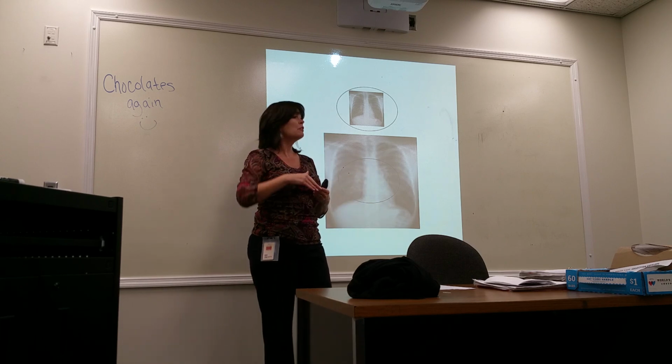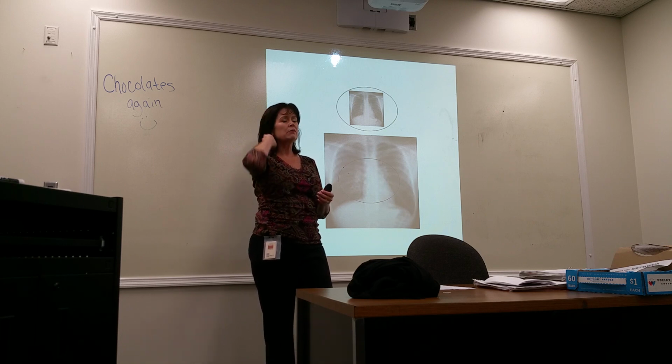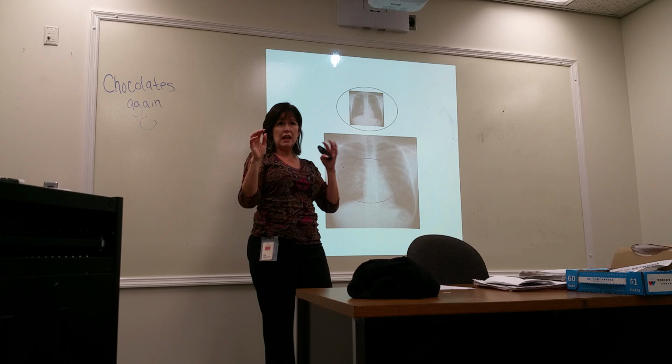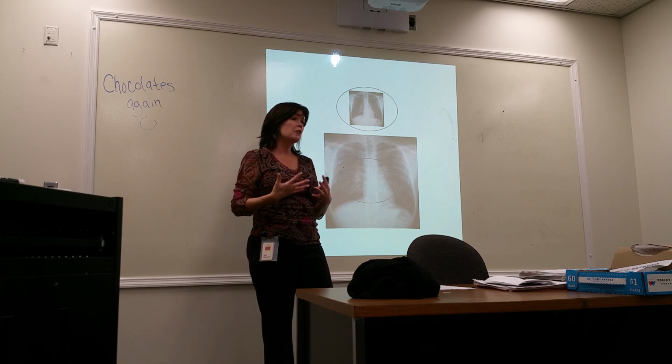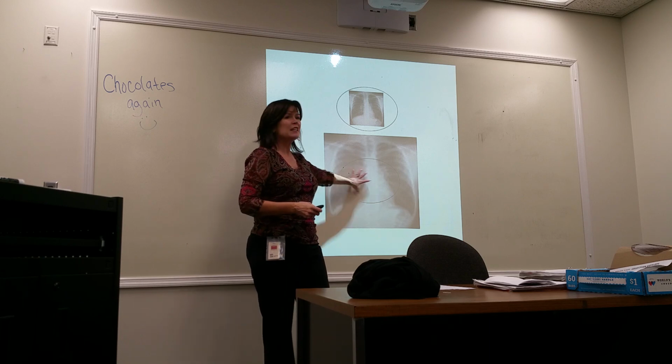Either mA increases or kV increases. Back in the old days we had to do it manually, but now it's automatic. You have that automatic brightness stabilizer where it kicks in and makes the image brighter.